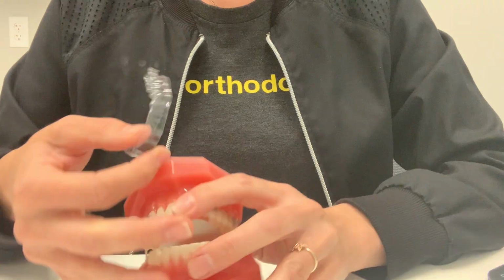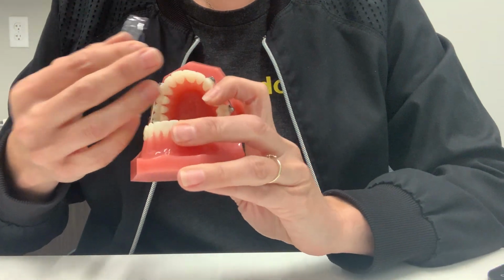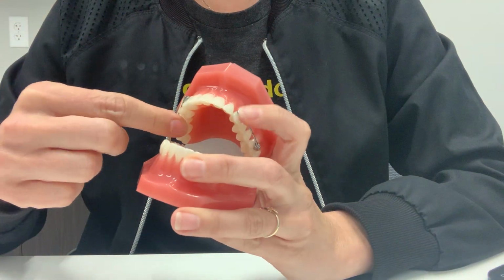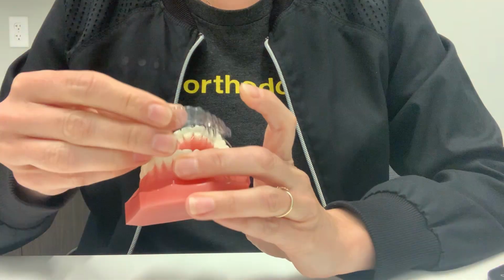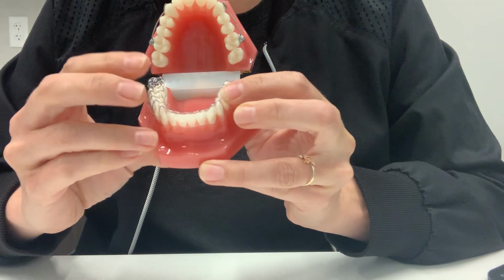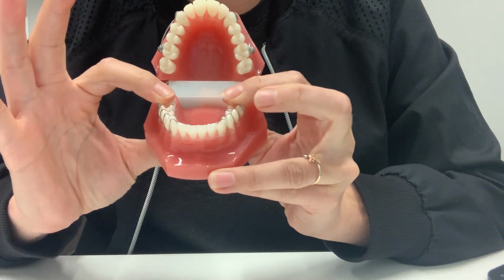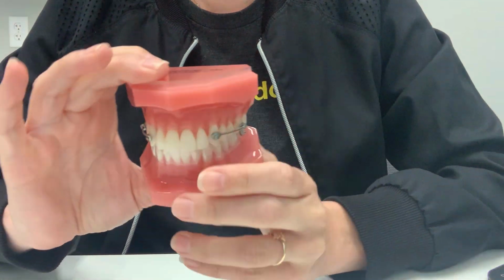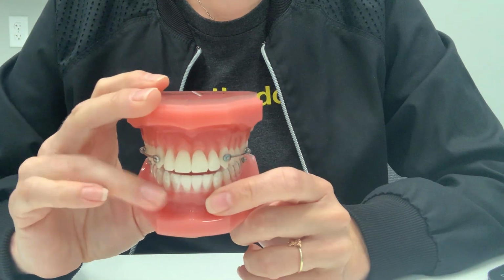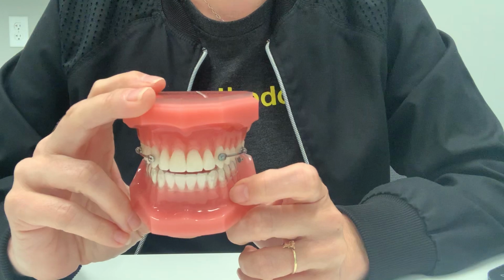To put the retainer in, you're going to line it up with the teeth, push it down in the front and then down in the back. You never want to put it in halfway and then bite it into place. Always push down with your fingers and then you can bite once it's totally in.